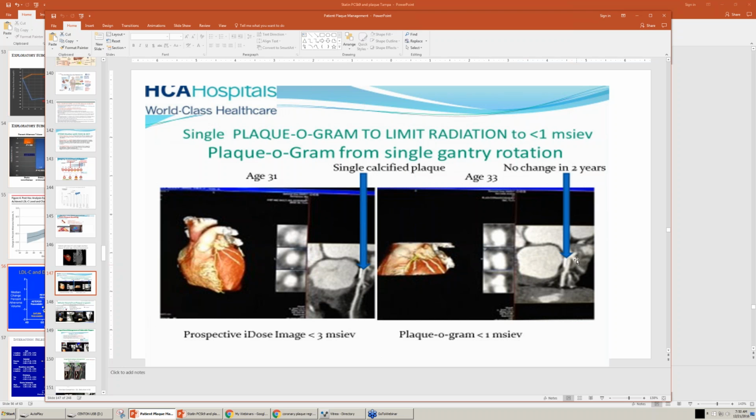So we got this and we compared it, and look, it's exactly the same. There is no change from this study to this study on this plaqueogram. And so this gentleman, I believe this is non-atherosclerotic, because I can find some areas of calcification elsewhere in his chest that if I plot them as points, I can see that there could have been a concussion wave produced by trauma injury to several areas to produce calcification.